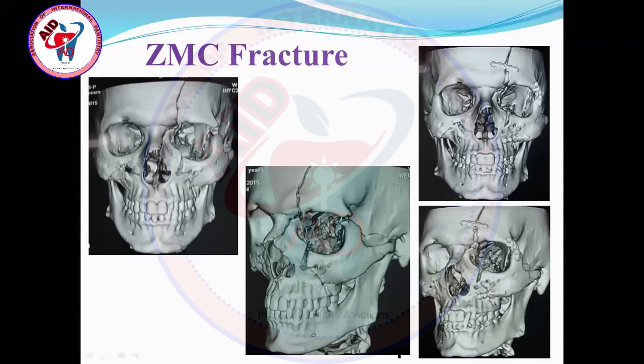Okay, on this patient, I will tell you how we have to fix. There could be just a reduction with conservative techniques if the fracture is stable. If it is not falling down, then leave it as such. That may also work. After reduction, let's go with the Gillies approach, and you are going just with the conservative techniques. If there is no falling down of that segment, then leave it as such. If it drops down, then open the zygomaticomaxillary buttress region and plate that area.